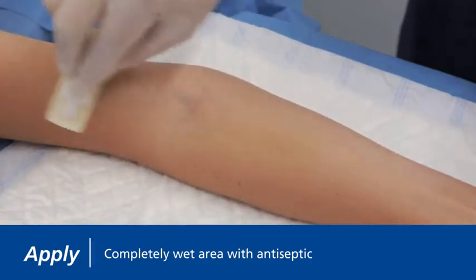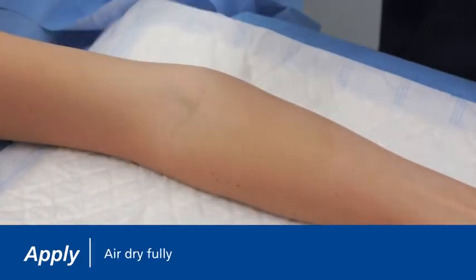Completely wet the treatment area with antiseptic. Allow the area to air dry fully. Do not blot or wipe away.